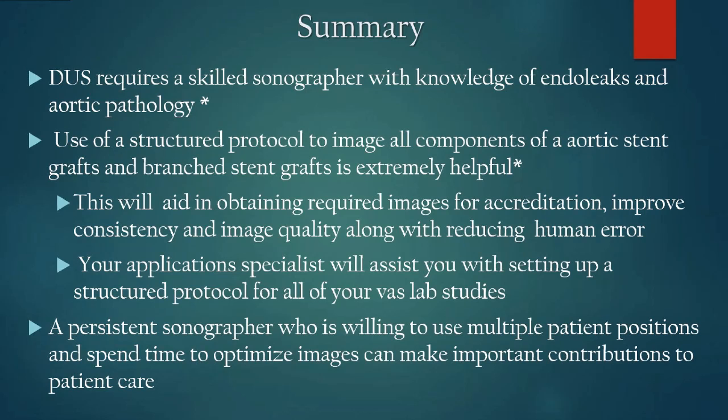The reader that's going to be reading these studies is going to be thrilled because every study is going to follow the same routine. Again, talk to your application specialist. They will assist you in setting up a structured protocol. And again, you can just open your manual or go online and pull up the website, and they're very easy to do. We customize all of our protocols. And a persistent sonographer who is willing to use multiple patient positions and spend time to optimize images can make an important contribution to patient care.